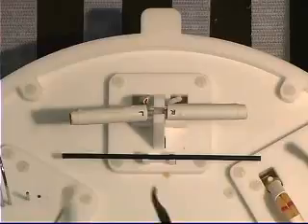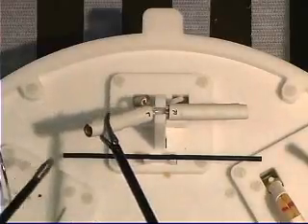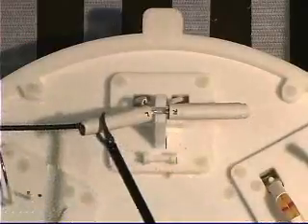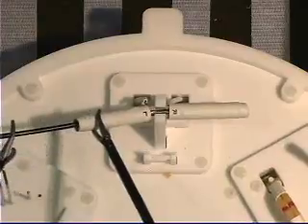The sequence is repeated with the non-dominant hand. 10 penalty points are assigned each time the cannula is dropped, up to a maximum of 20, and the cutoff time for this task is 100 seconds.